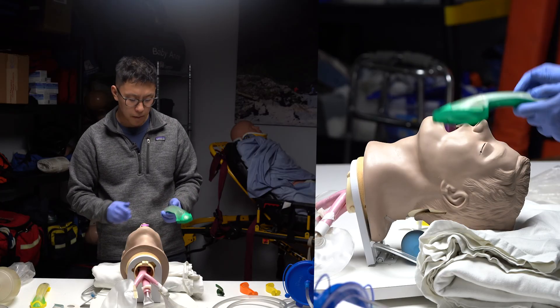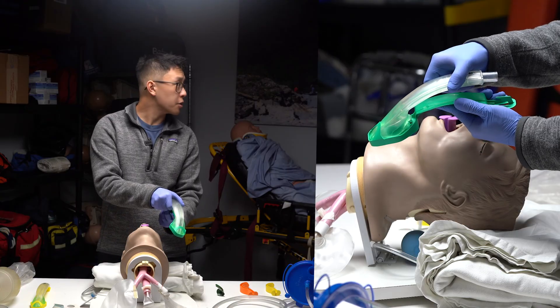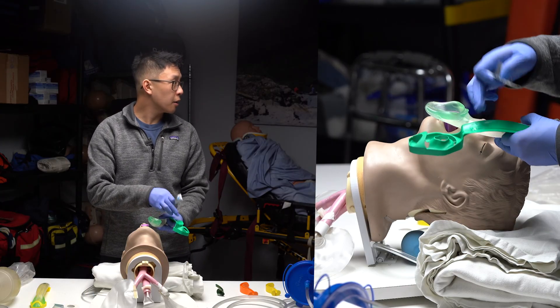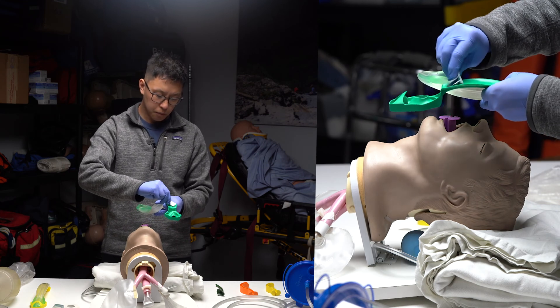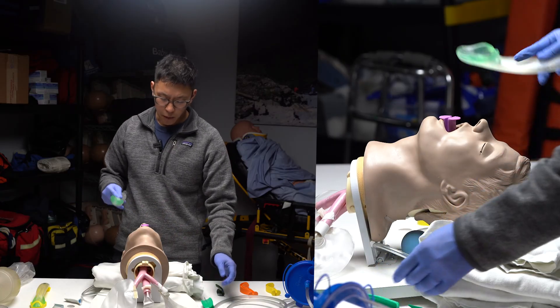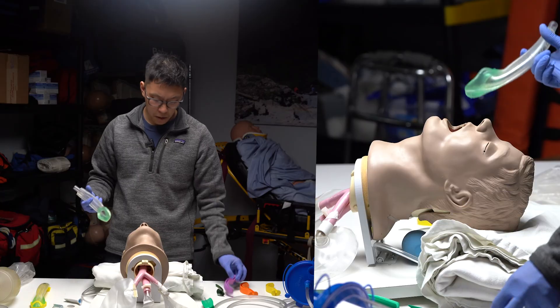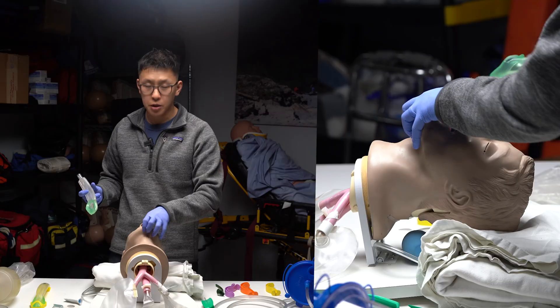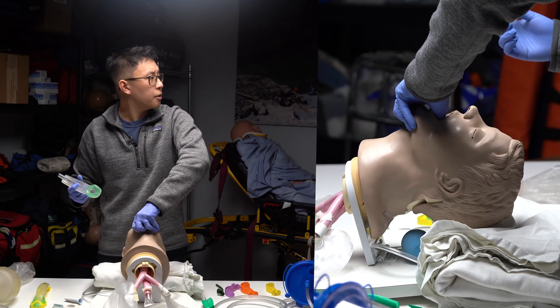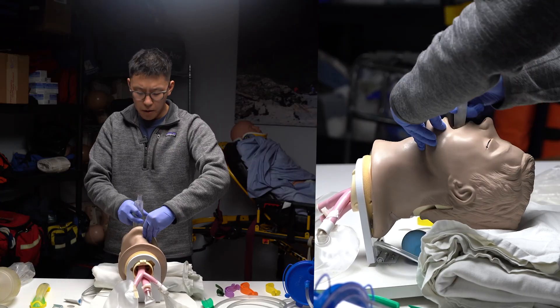Take the holster in your non-dominant hand, grab the i-gel with your dominant hand, push forward to unholster it, then flip it over and place both in your non-dominant hand. Grab some lube, place a dab on the holster dimple, and lubricate only the back side — not the front side, which needs to make a good seal. When ready, tell your partner to stop ventilating; you or they can remove the OPA. Provide a tongue-jaw lift — thumb on the tongue, four fingers on the jaw — lift so the head comes slightly off the table, and insert the i-gel until you meet resistance.